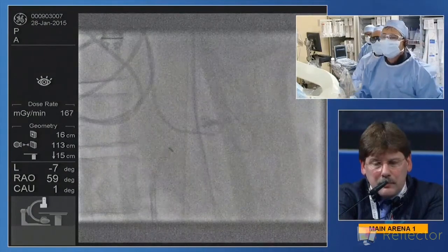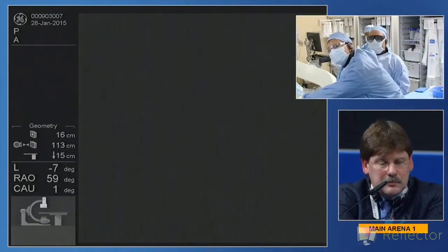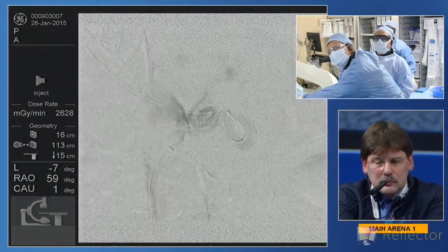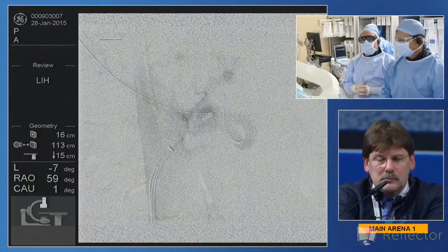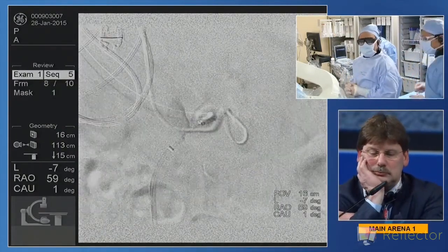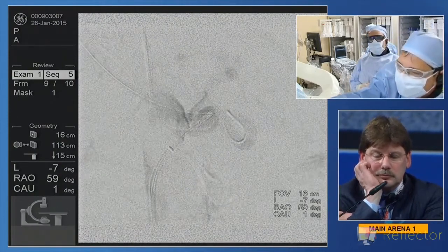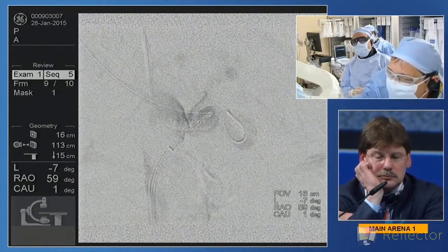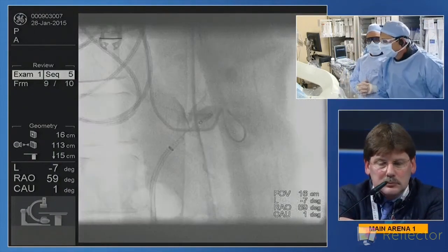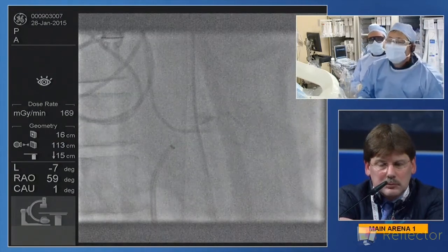Right. Okay, so I just pulled back our guide. Let's see if we can get some imaging here. All right, so there we see where we have to go. Let me mark that. Pen. Play that back. All right, so I'm just going to mark on here where we have to land this. We have a TIMS auto trace that Dr. Herman was instrumental in developing, but we do have it ready for use, John.